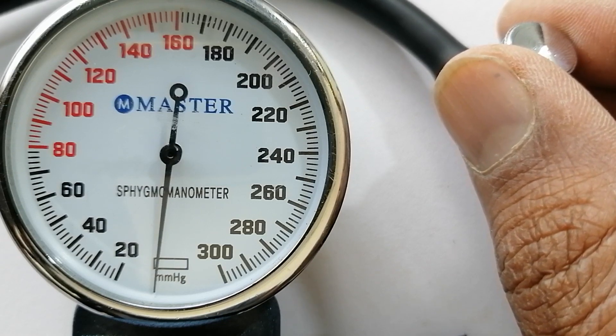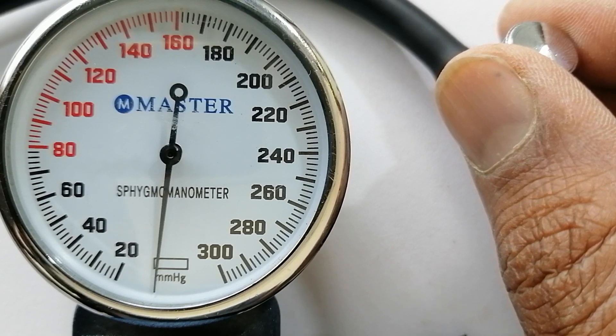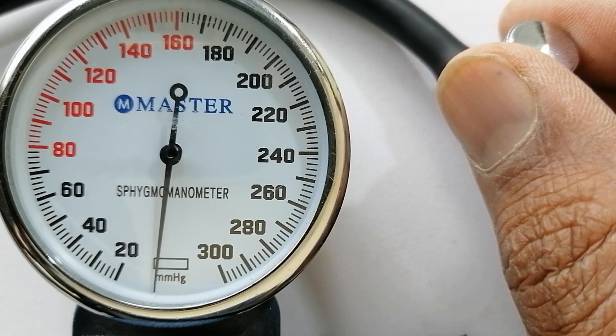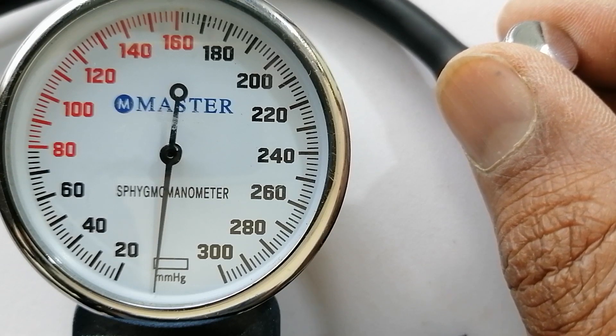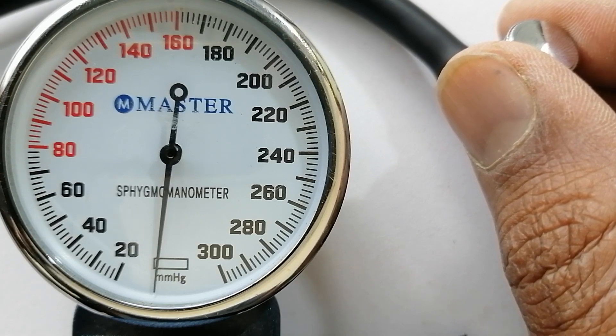Was it at 120, was it at 130, or was it at 140? The point is to note wherever it is. After that you will keep getting the sound, and this will eventually lead to a place where you will stop hearing the sound again.